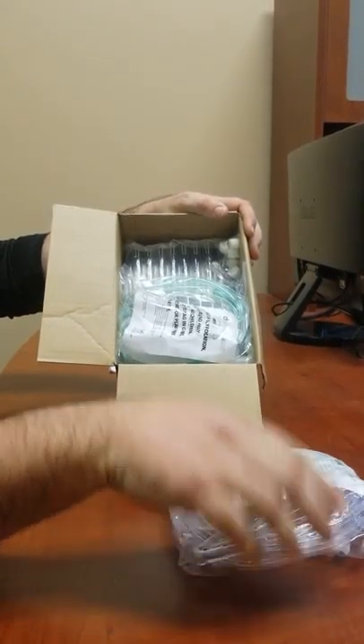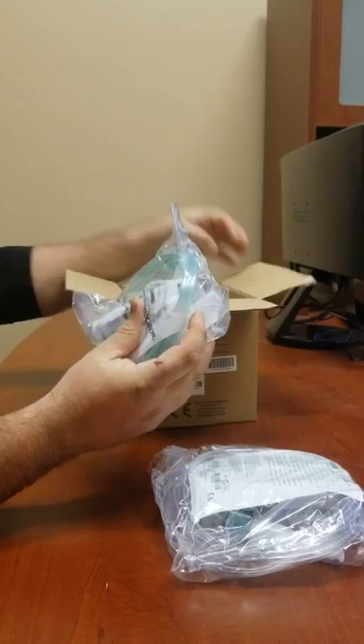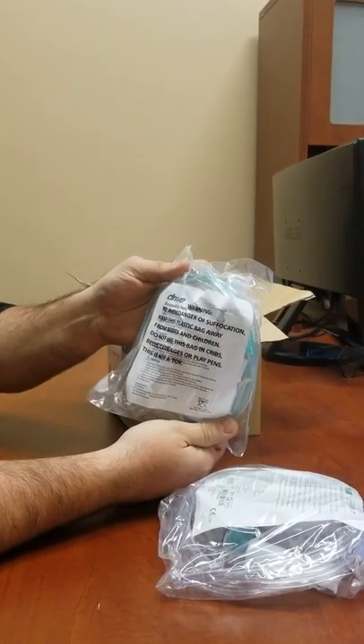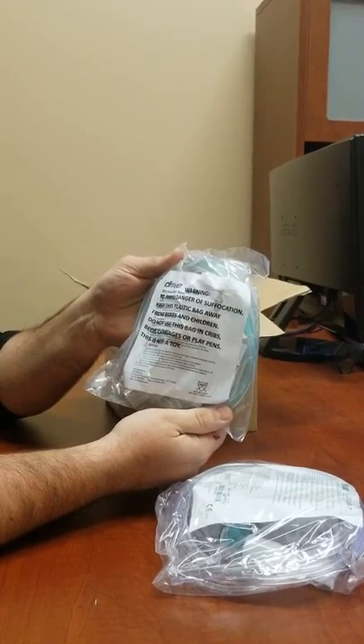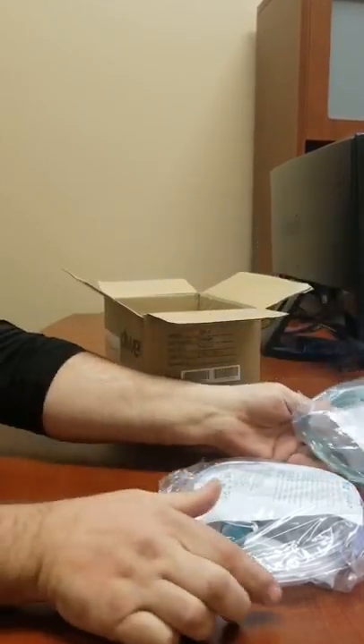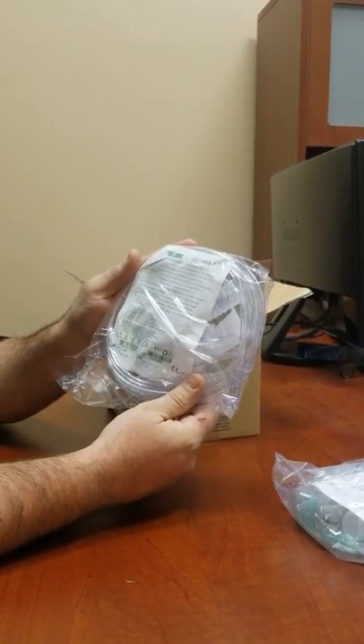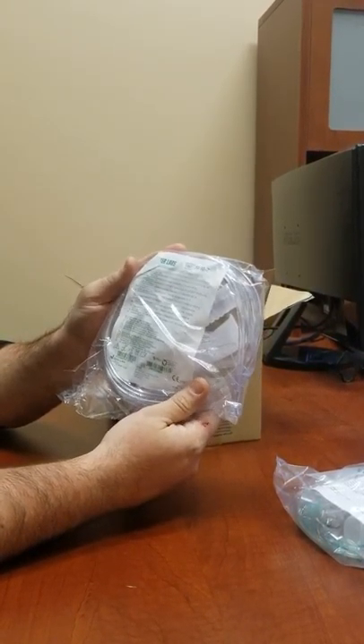You'll have two neb kits. One is a reusable — it'll be the green tubing one — and it is good for every six months. You'll also get a disposable one which is good every month, and you should be able to get two of these every month.